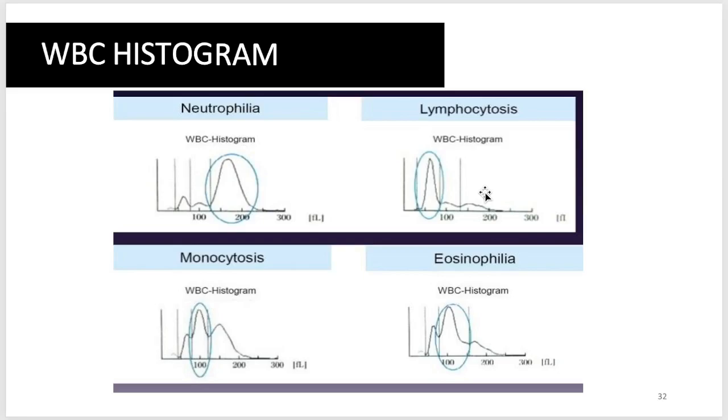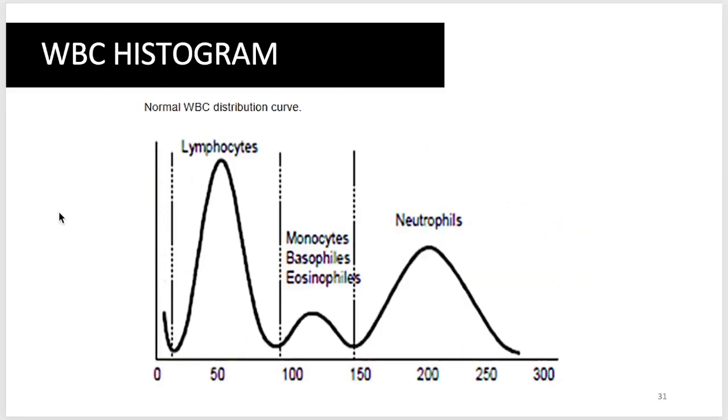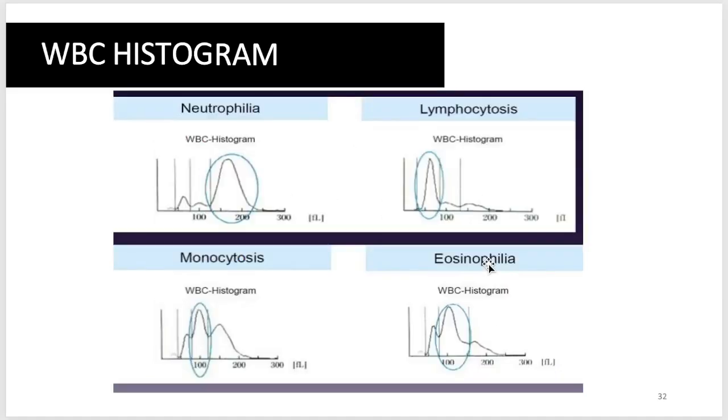However, based sa tatlong parameters na to, sino ang mahirap i-detect? This parameter, your lymphocytes, this one, your mid, or your neutrophils. Ano kaya dyan? Alin kaya doon ang mahirap i-detect? Your mid cells, your neutrophilia, or your lymphocytosis? Sino ang mahirap ma-distinguish?